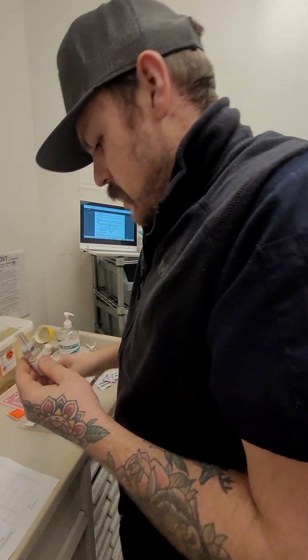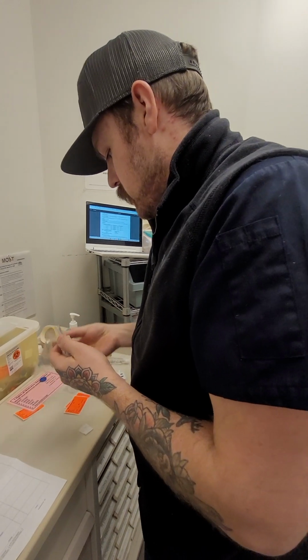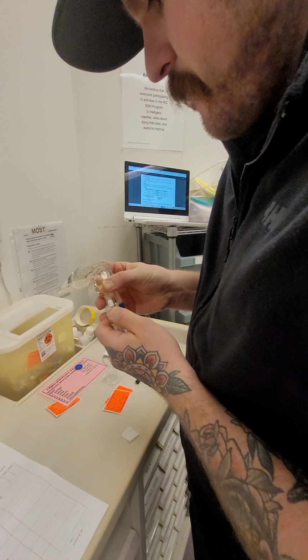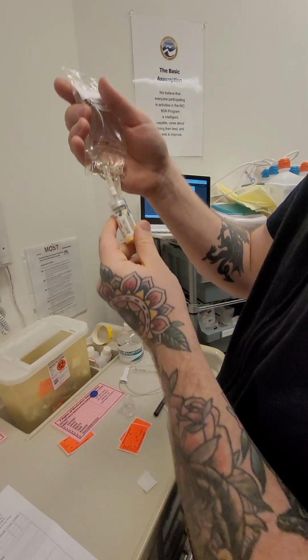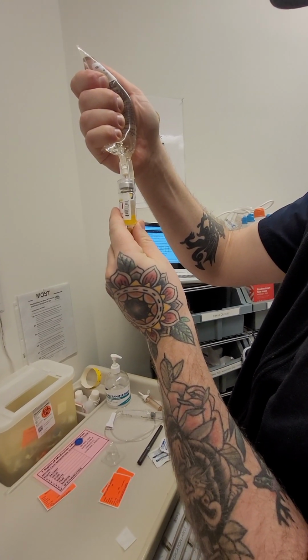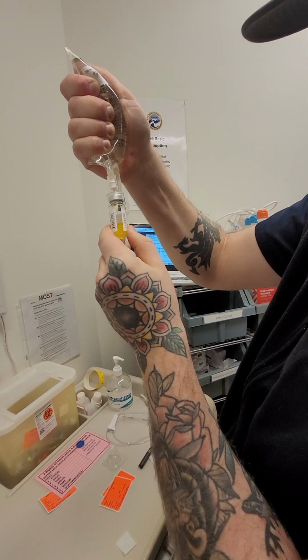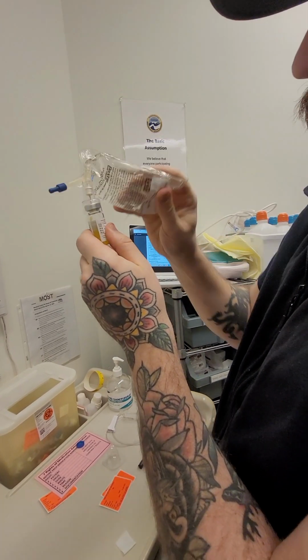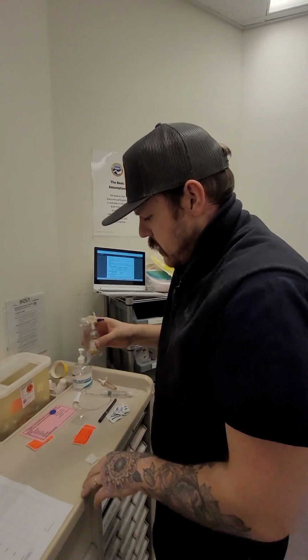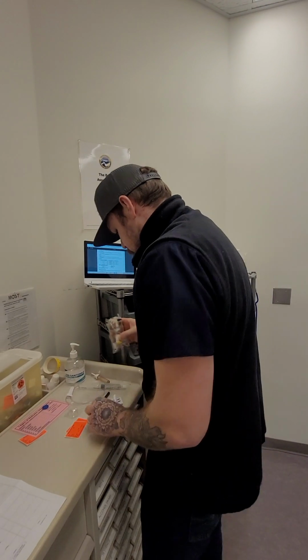Perfect. Now we've got this. This is still sterile, and then we're going to add it to our medication, or fluid here. And we're going to go ahead and displace some of this fluid into the medication vial here. Perfect. Now we're reconstituting it. So we've got to make sure that all the medication is mixed here. So I'm not shaking it, I'm just giving it a gentle stir.